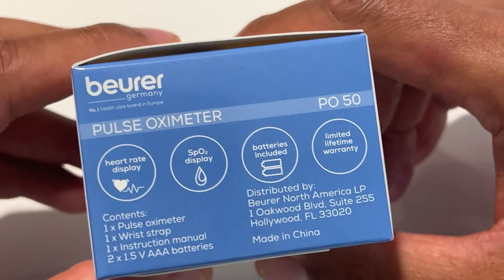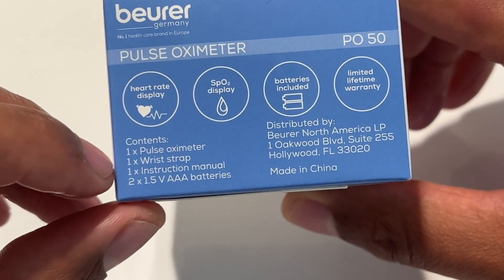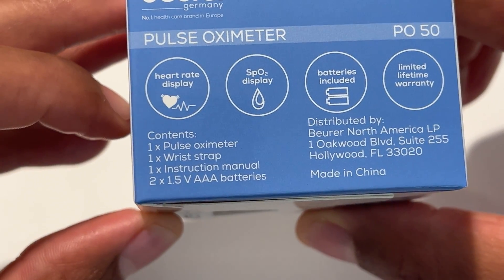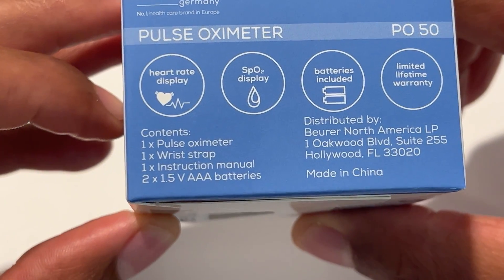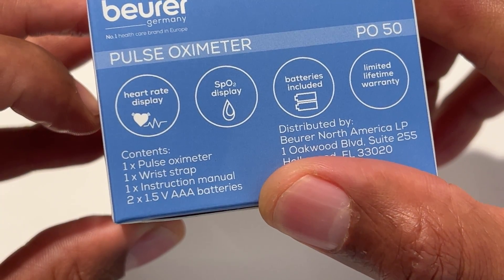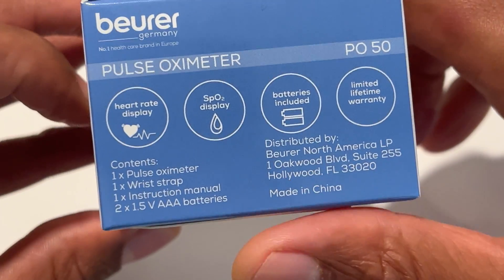Opening this up again, it says the same things on the side, except right here it says what's inside: one pulse oximeter, one wrist strap, one instruction manual, and two 1.5-volt AAA batteries.